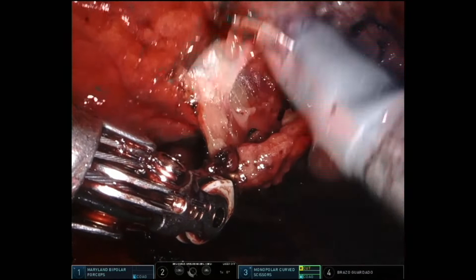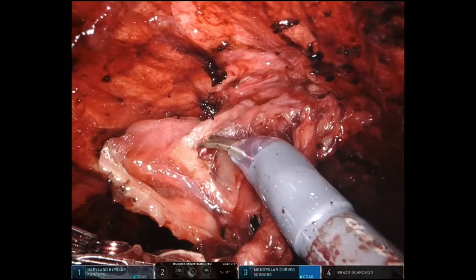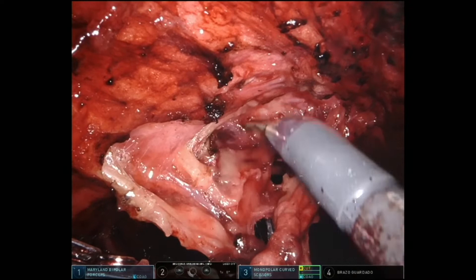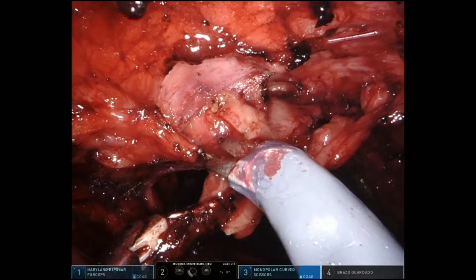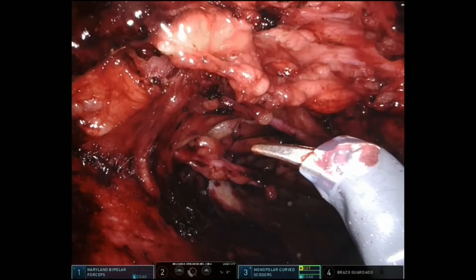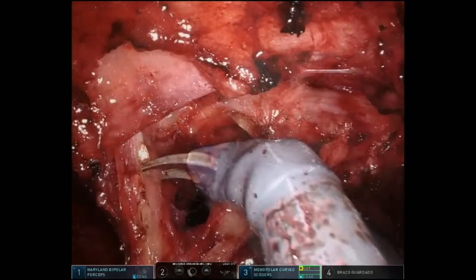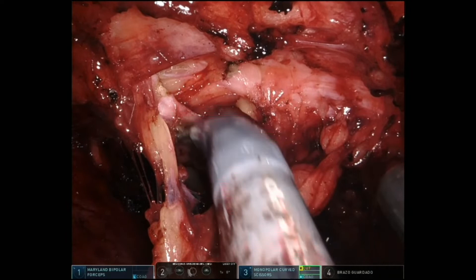This is the key of this surgery - it's completely the opposite of what you do when you go open. You have to start down at the bottom of your plane at the Scarpa fascia, and then when you have already developed this posterior plane, go up and try to connect Camper's fascia with Scarpa fascia. Then you have everything. As you can see here, I can preserve many of these branches that are draining to the saphenous arch. It's also important to do a nice dissection - we know that node density is an independent risk factor of recurrence in the groin, and in penile cancer recurrence means decreased cancer-specific survival and overall survival.